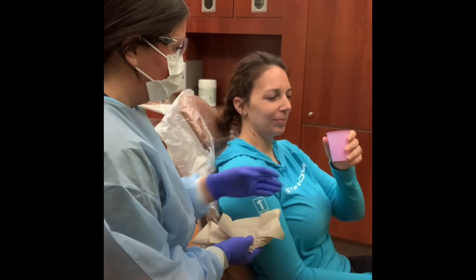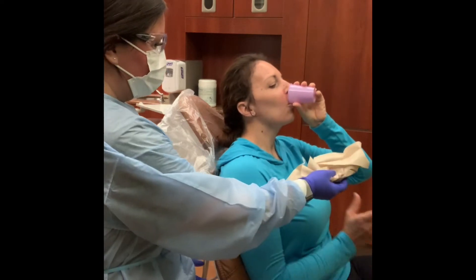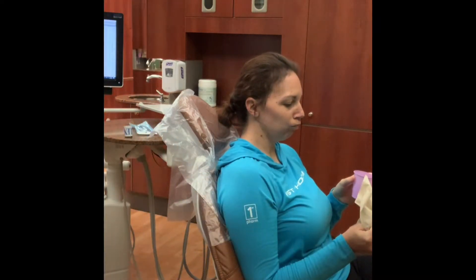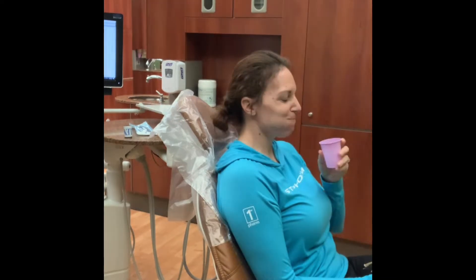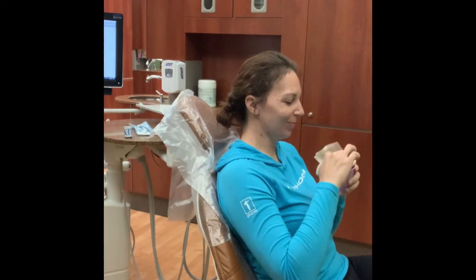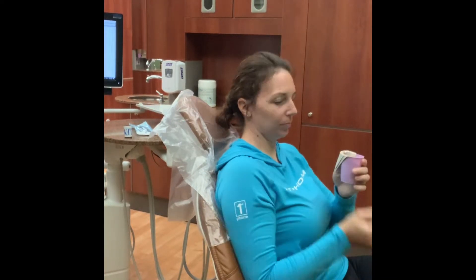Always begin with an antimicrobial pre-rinse. Have the patient expectorate back into the cup and stuff the paper towels down inside to prevent spilling in the trash can.